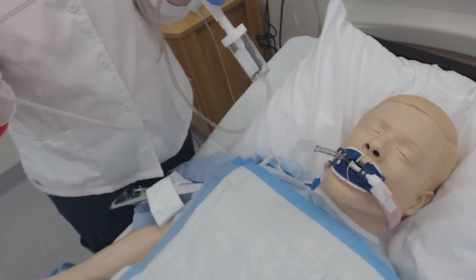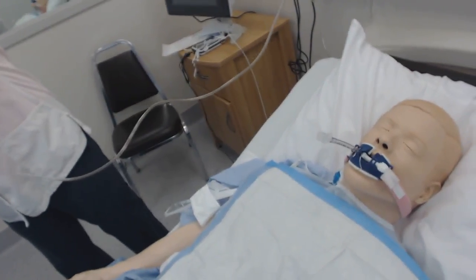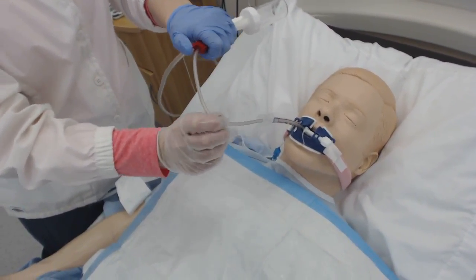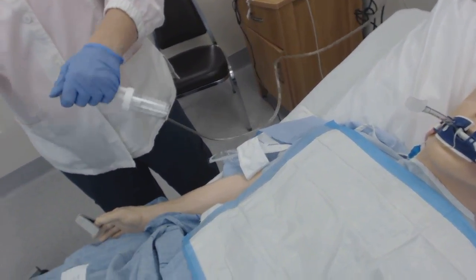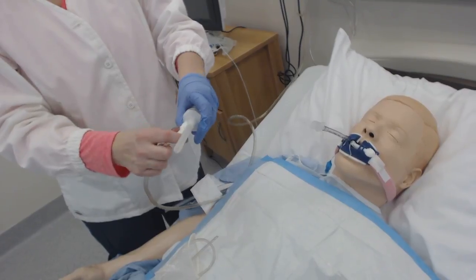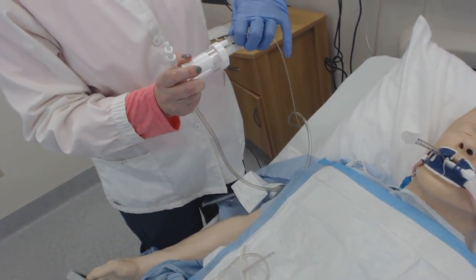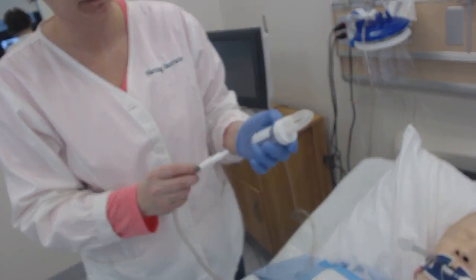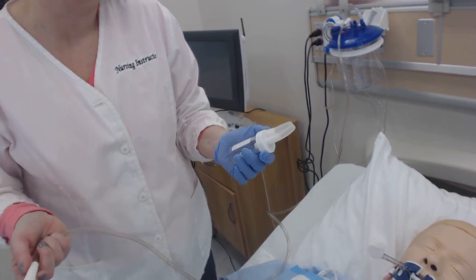But if you only get maybe five, five will be good. Now, you're going to get rid of your catheter. Then you're going to take this and date it, time it, and initial it — who the patient is, medical record number, and their date of birth. That's it.